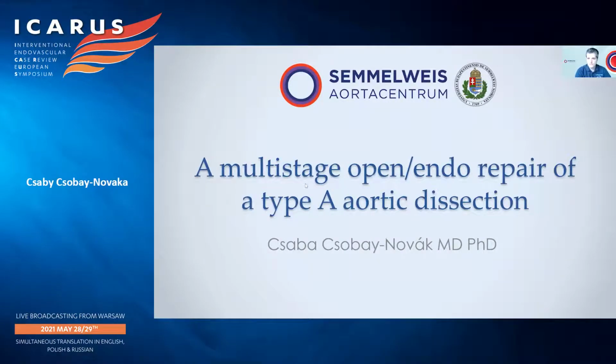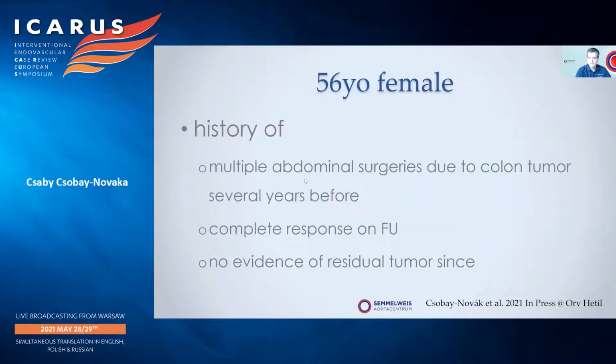I'm from Budapest, Hungary. My case is a multi-stage open-endo repair of a type A aortic dissection. So our case is a 56-year-old female with a history of multiple abdominal surgeries due to colon tumor several years before. She's in complete response since.